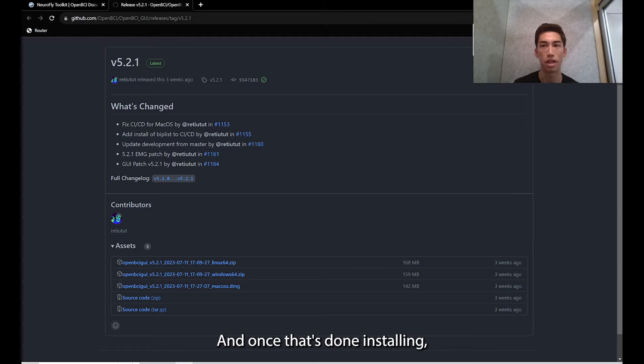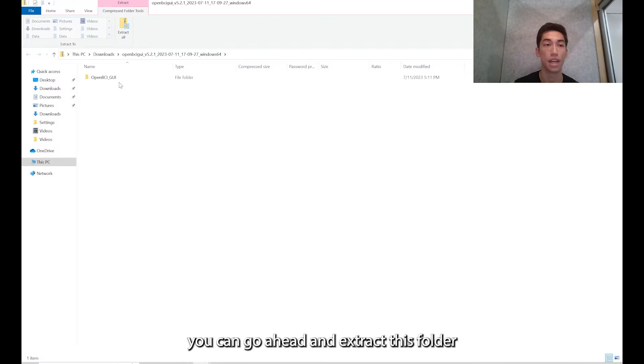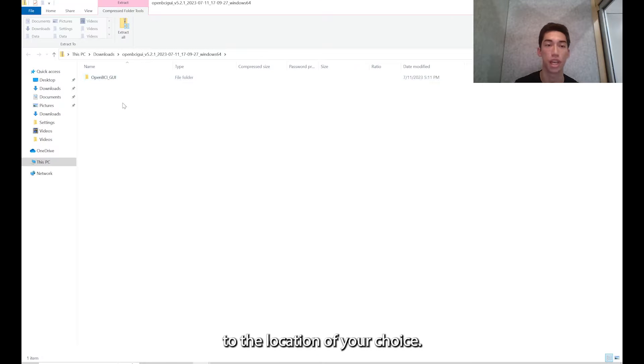Once that's done installing, you can go ahead and extract this folder to the location of your choice.